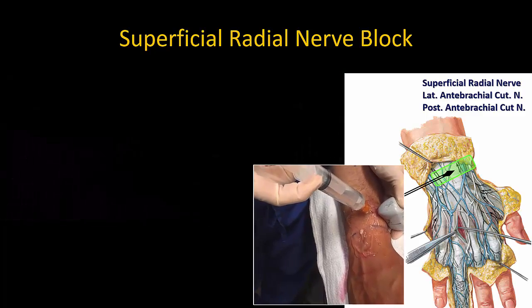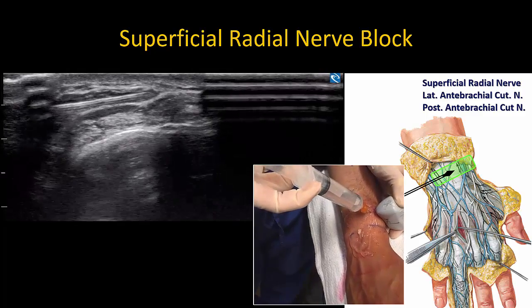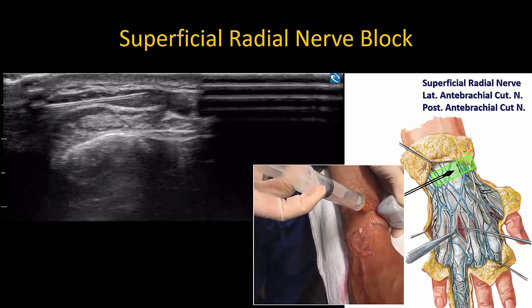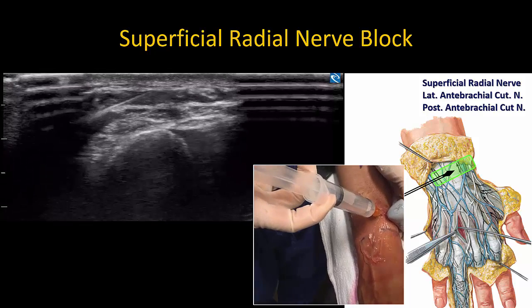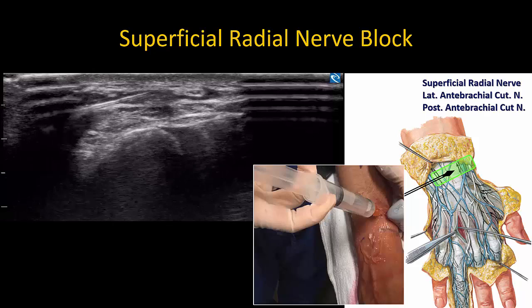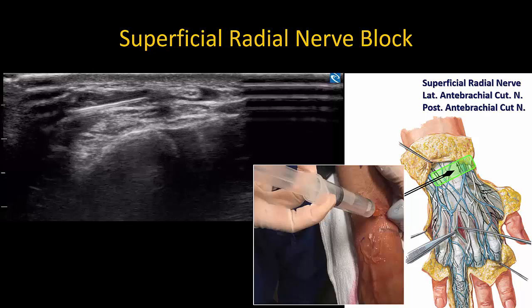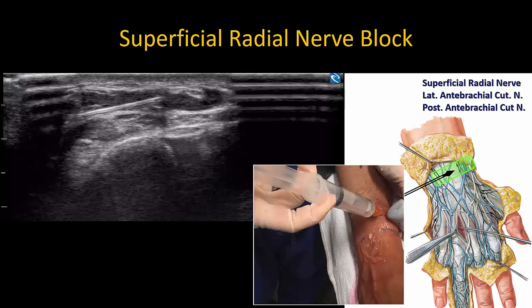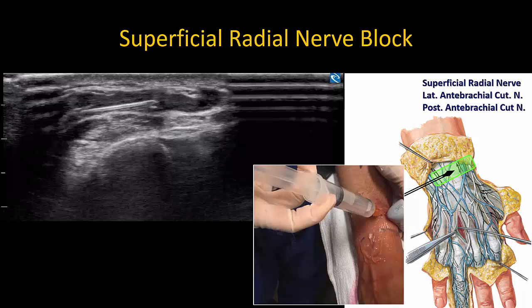The nerves often become visible as local anesthetic spreads around them. The infiltration technique has the added advantage of anesthetizing the terminal branches of the lateral antebrachial cutaneous nerve, which often contributes to innervation of the dorsal first web space and base of thumb, as well as terminal branches of the posterior antebrachial cutaneous nerve.